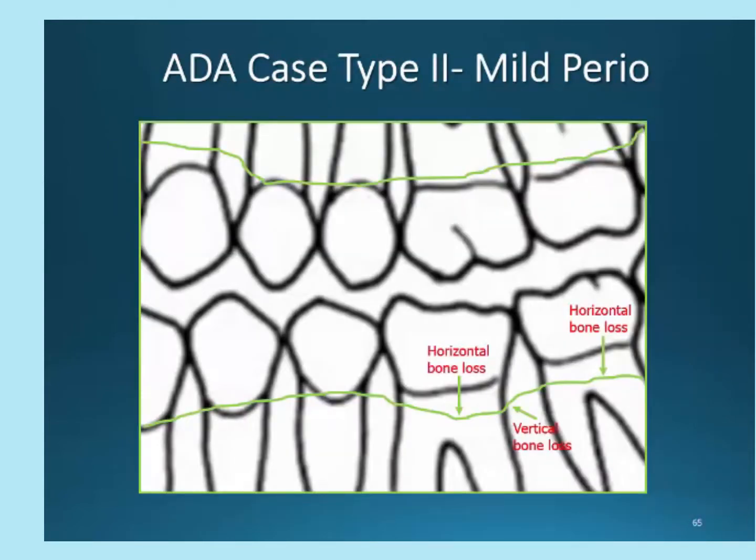This slide demonstrates how we will chart periodontal bone loss in our clinical charts. Note that we have identified horizontal and vertical bone loss changes. Bone loss must be carefully documented for comparison between dental visits. When illustrated, it is easy to read. These drawings should coincide with the numerical probing depths that you chart.